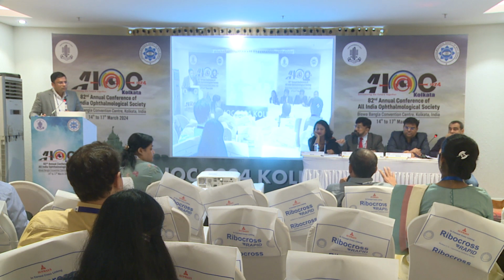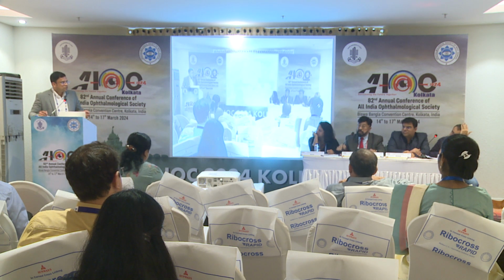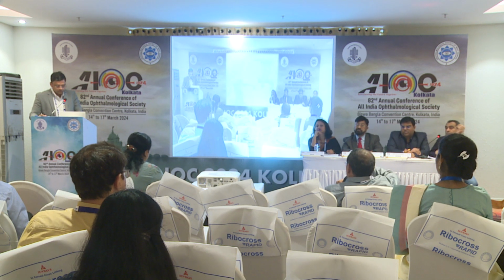It's not an SF lens, it's a normal IOL, a normal toric IOL, which is stitched to the sclera. There is a tilt also of the eye. Ah, that's an additional thing. Yeah, that is a possibility, but probably it's a gross astigmatism. What was the outcome?